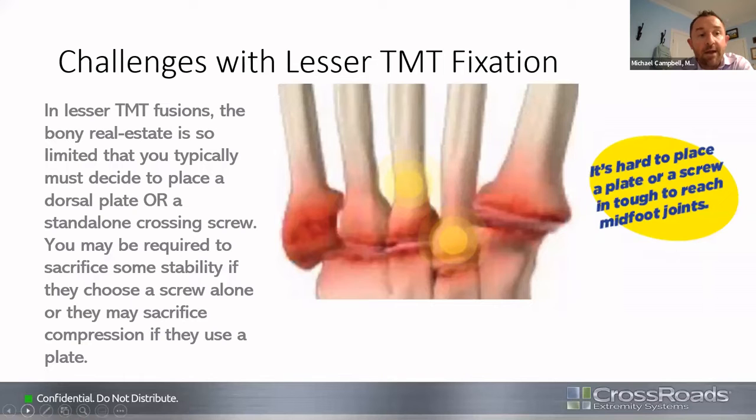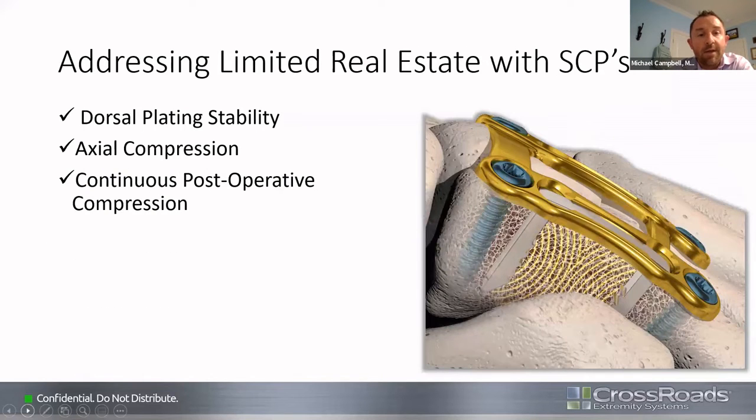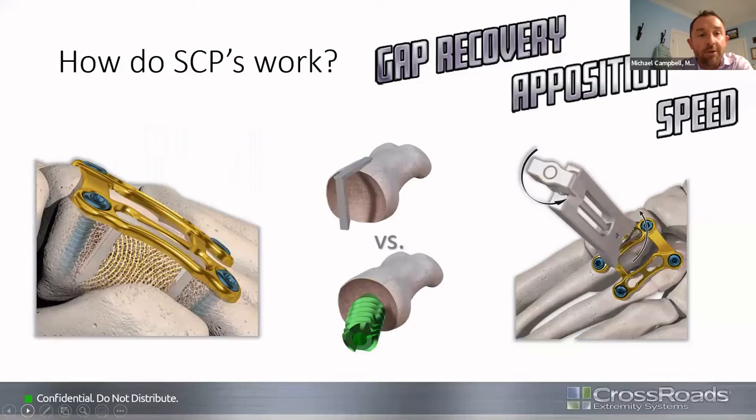And these are small joints without a lot of surface area. So you want to maintain as much bony contact as possible. So dorsal plating, axial compression, continuous post-operative compression, and biomechanically, you're creating a plantar tension band from a dorsal approach.